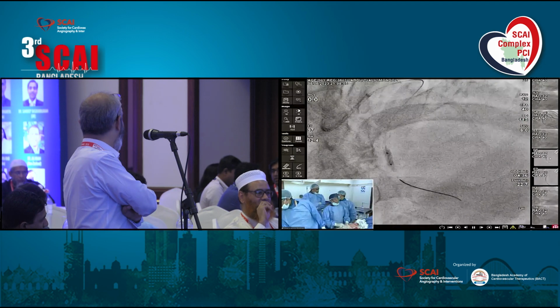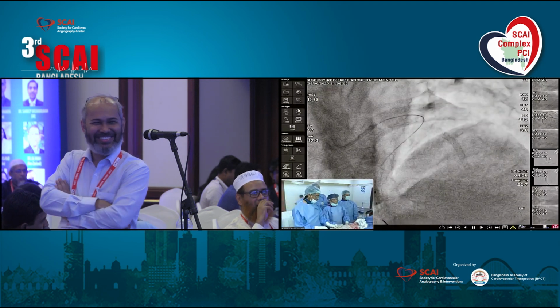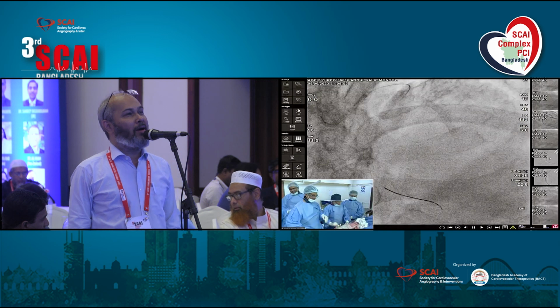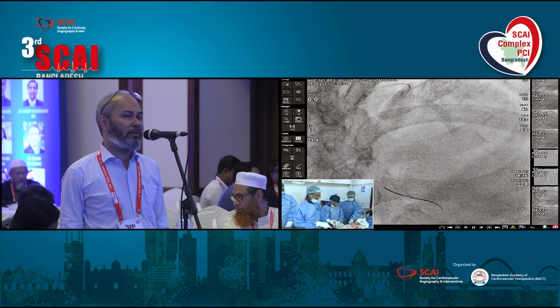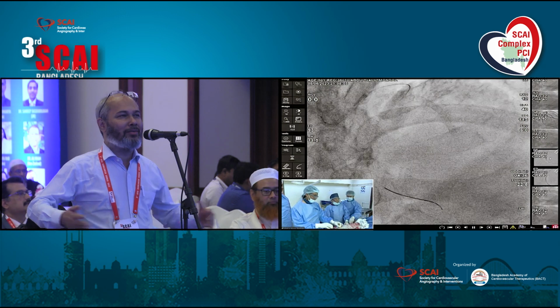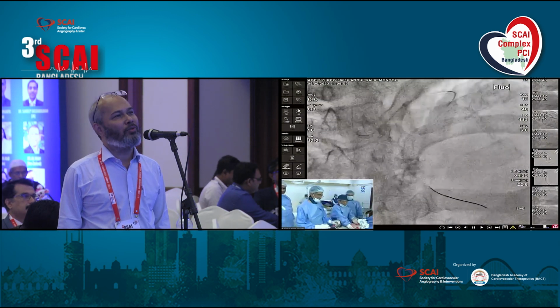Another 30 minutes, Professor Azam. 30 seconds. Okay. Just two views. One demand, he loves to see the final stent boost. Final stent boost. Oh, the balloon is already removed. Okay, forget it. So you take another view, a good view. The balloon is out. Just take a good view.